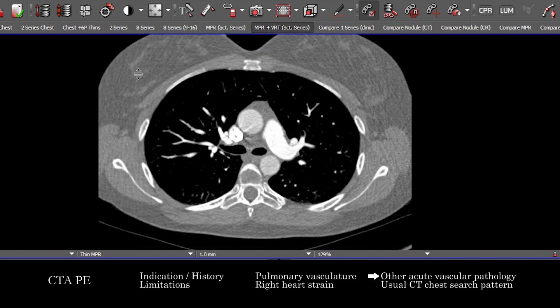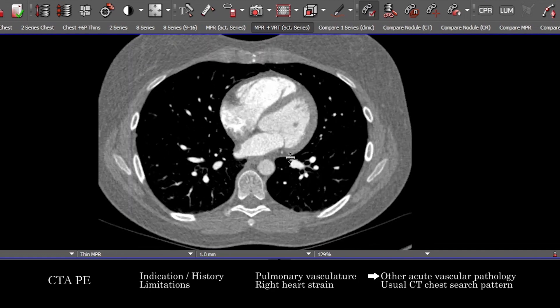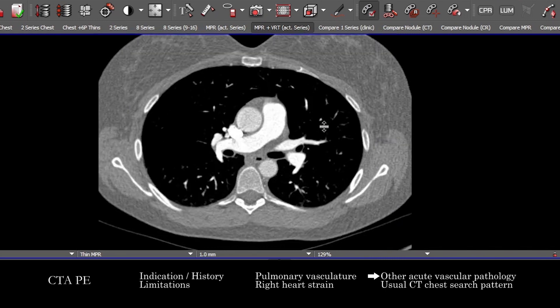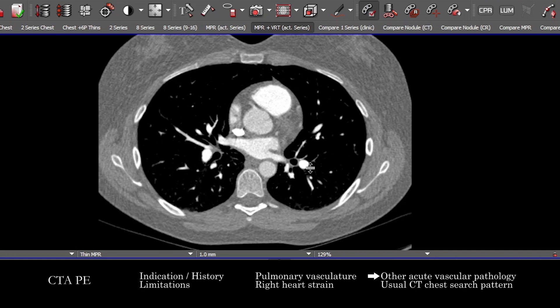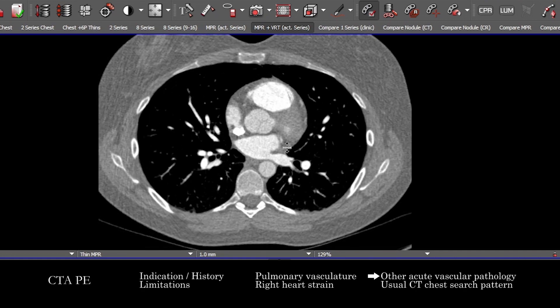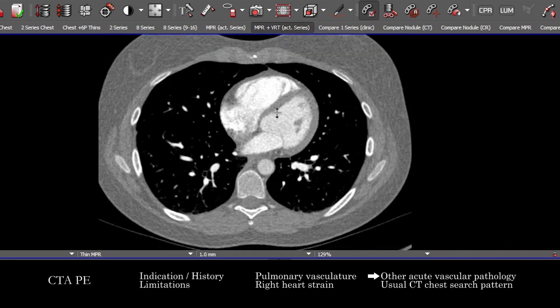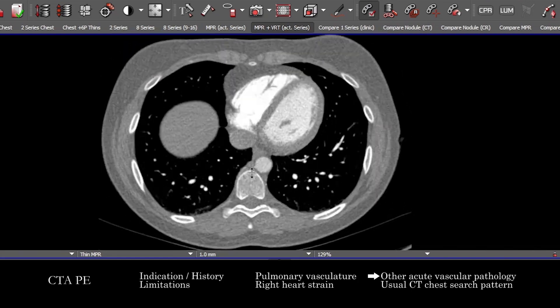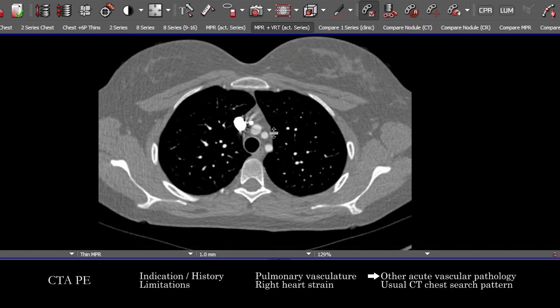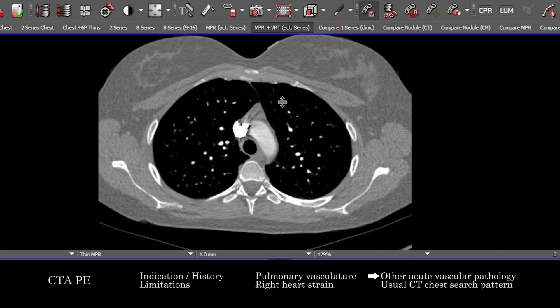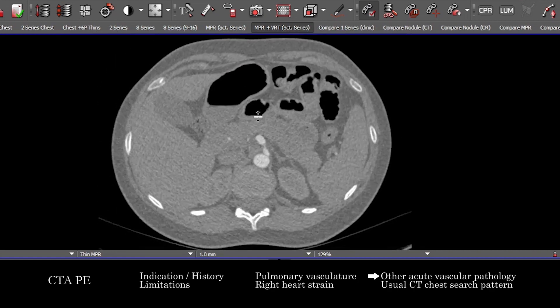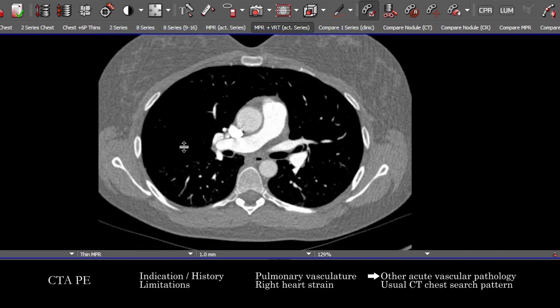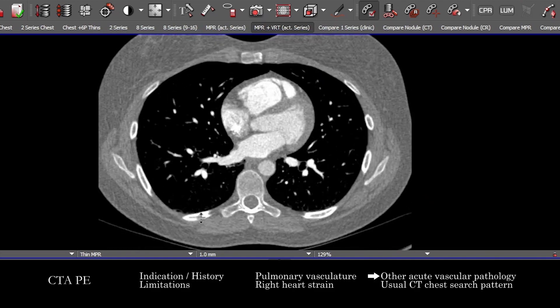Once you've looked for pulmonary emboli and signs of right heart strain, look at the other vasculature opacified by the contrast bolus. We can see part of the systemic vasculature — going from the aortic root, looking for normal coronary artery origins even though this is not a gated study, then following the aorta up into the arch and those branch vessels out to the periphery, and the aorta down into the upper abdomen and its main branches, looking for normal course, caliber, and any acute pathology including intramural hematoma, dissection, and aneurysm.